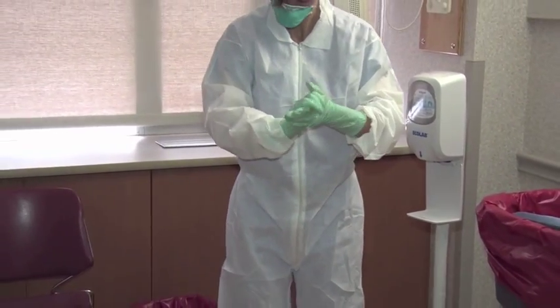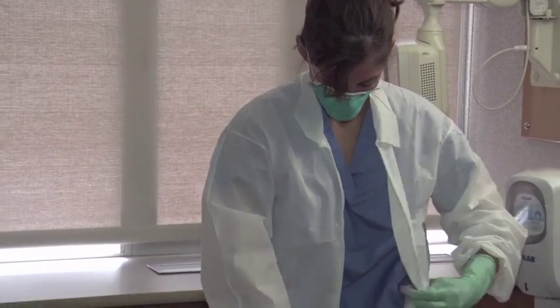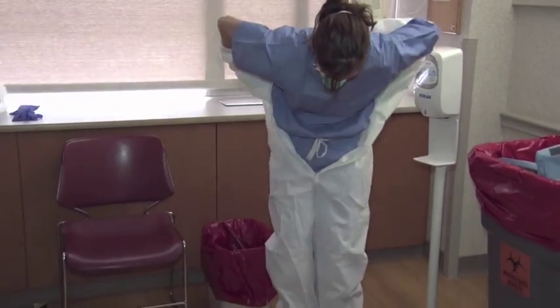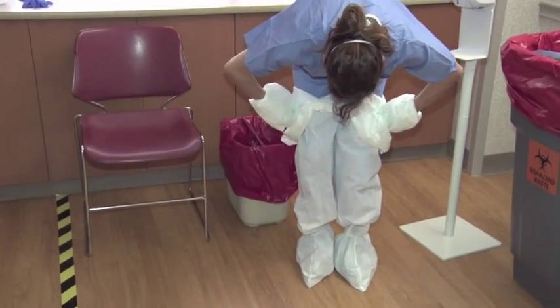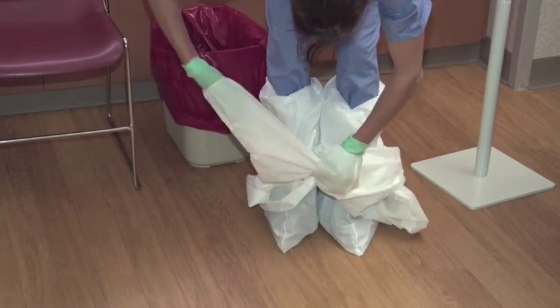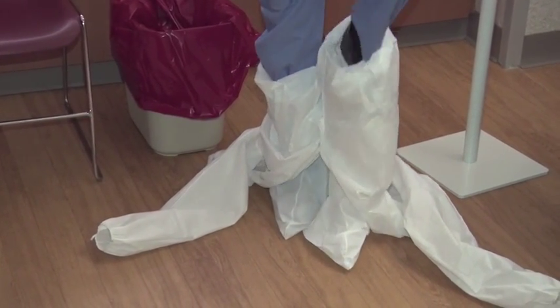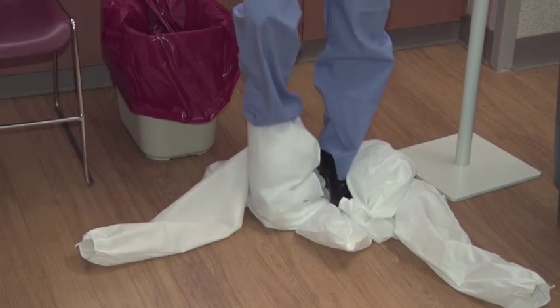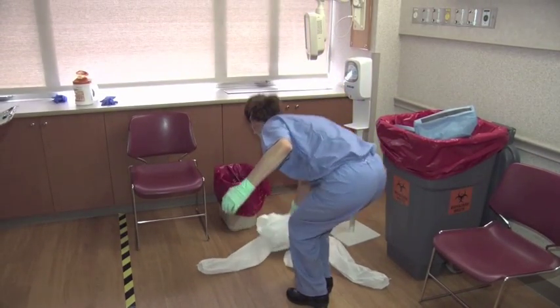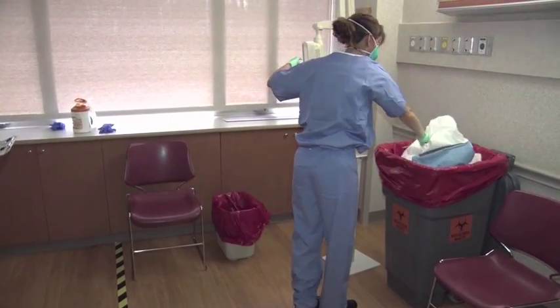Remove coveralls: tilt the head back to reach the top of the zipper, unzip completely, then roll down turning inside out. Avoid contact of the scrubs with the outer surface of the coverall. Step forward out of your coveralls and pick up and discard them. Some employees may find it easier to sit while performing this procedure. Inspect and disinfect inner gloves.